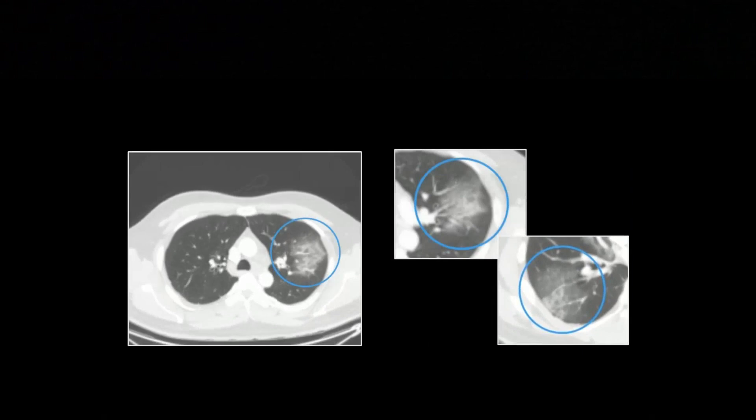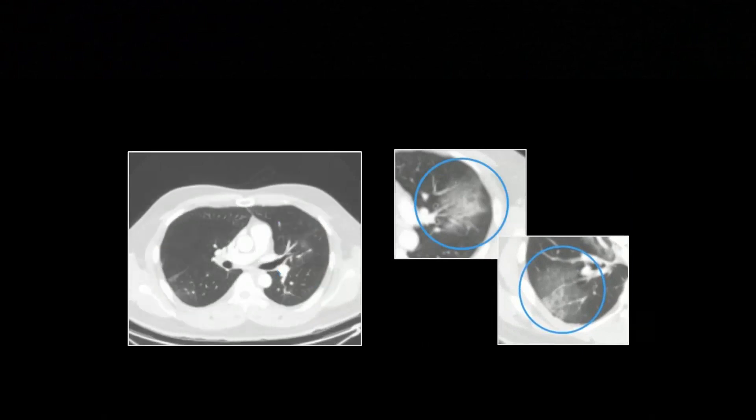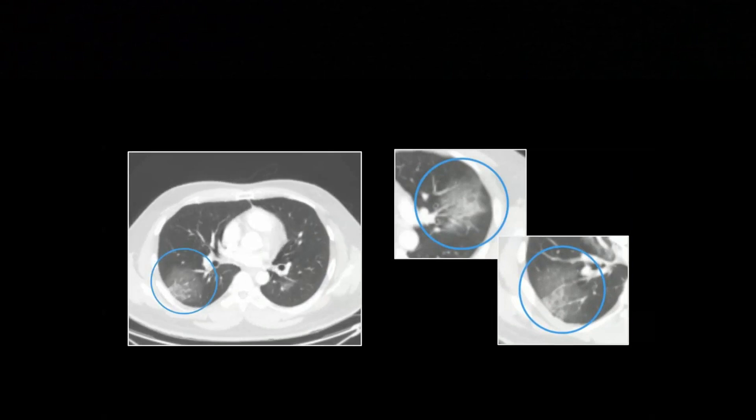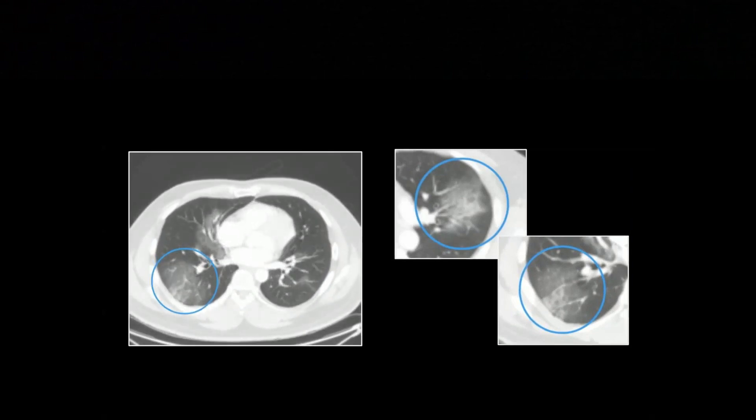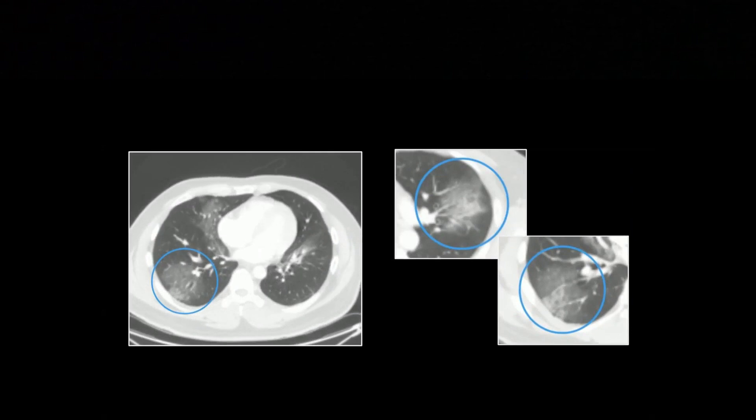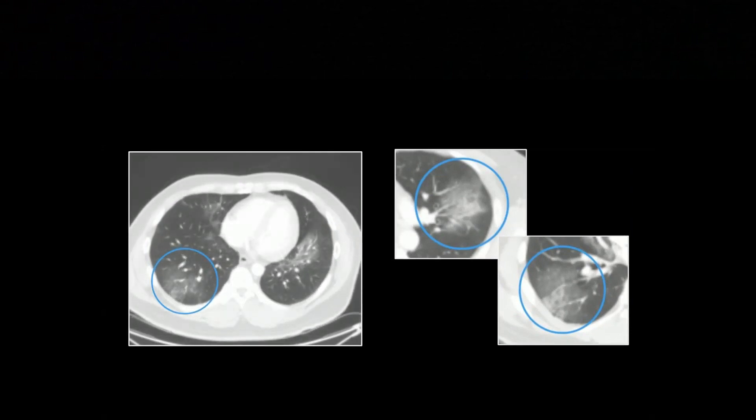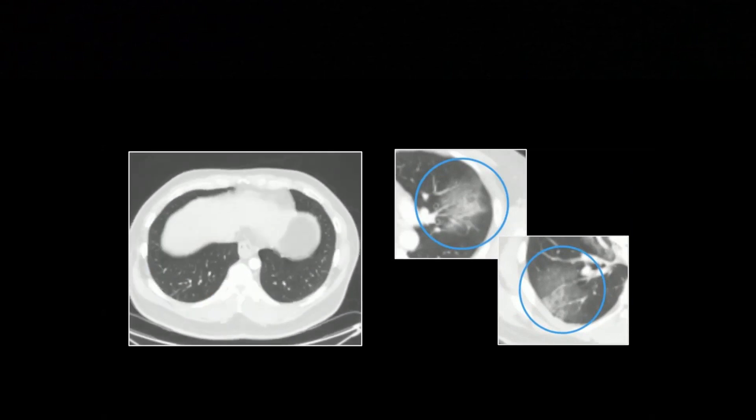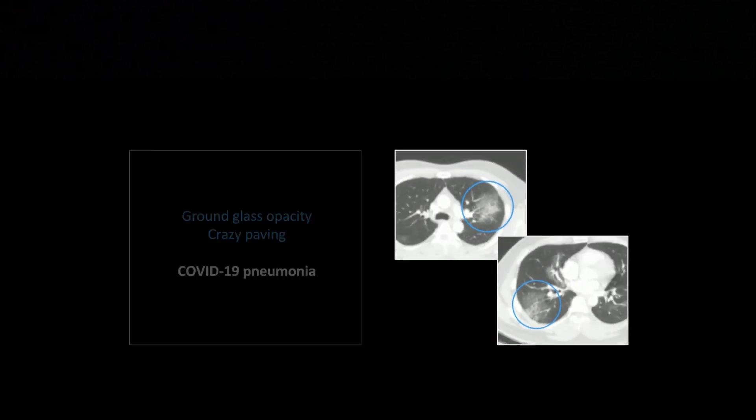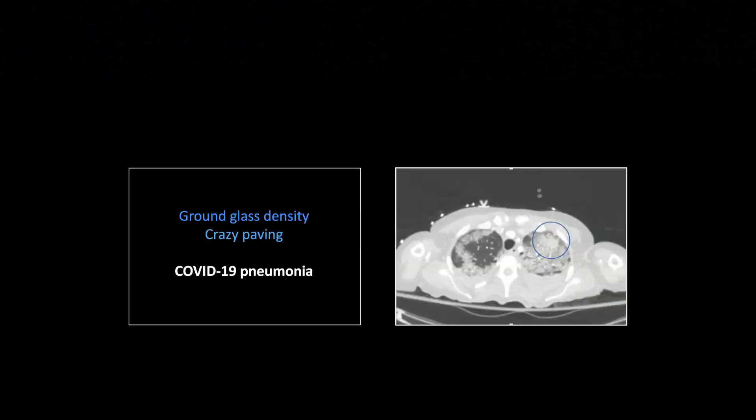It's bilateral, rounded, and peripheral in location. See how it goes out to the pleural edge there in both cases? There are a bunch of other patches of ground glass density elsewhere in the lungs. That's one of the first cases of COVID to hit the country. That actually came from the Bay Area.